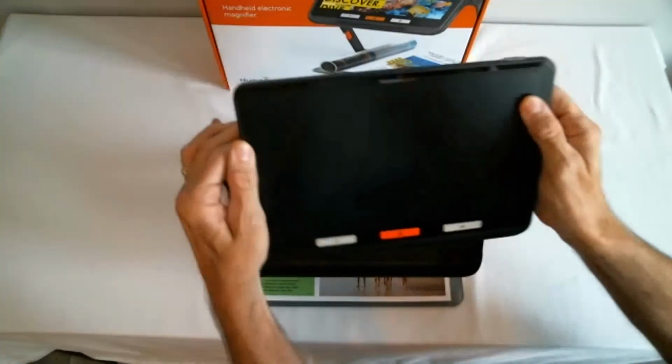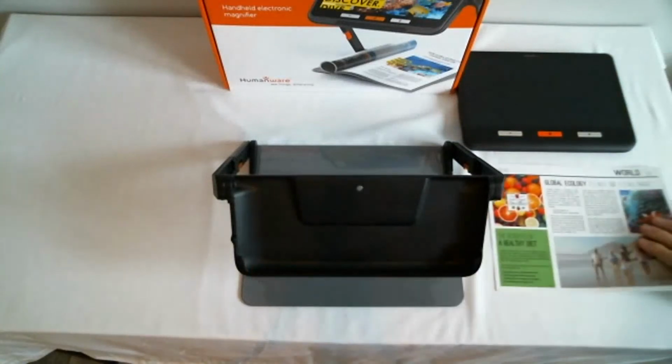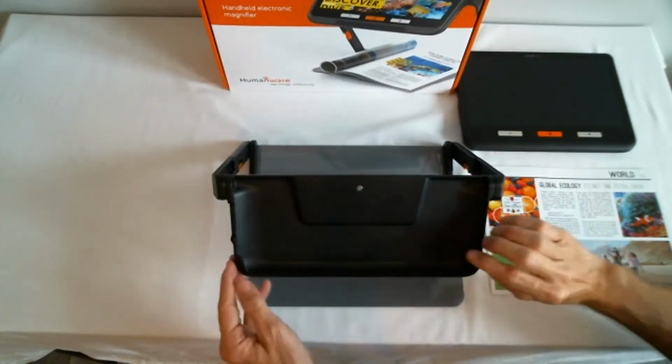I say I'm done reading now. I can take my device back out of the stand. I'll remove my document. And now I want to fold it up because I'm done reading for the day.